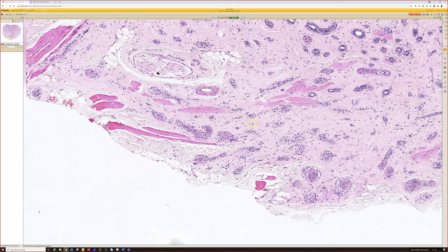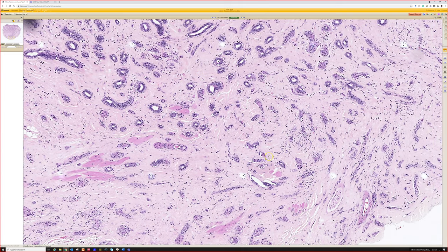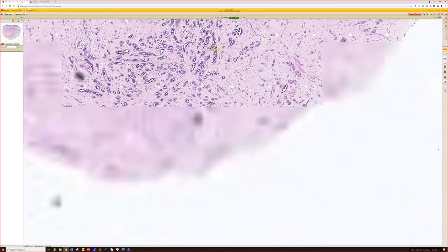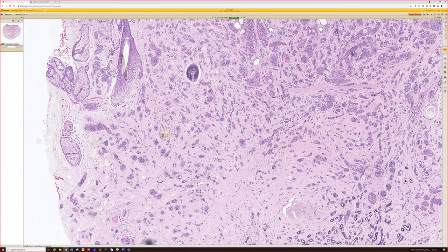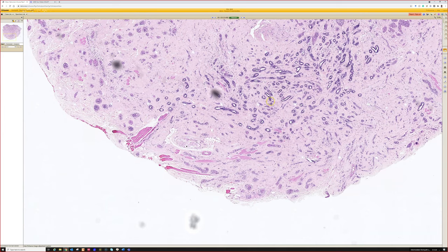So a lot of times to make this diagnosis with certainty, I really need to see a deep, full thickness biopsy. I feel like it's a very hard, if not impossible, diagnosis to make on a shave because they can very closely resemble desmoplastic trichoepithelioma. This one doesn't because it has obvious ducts, but a lot of times they can have areas that look, to my eye, identical to desmoplastic trichoep. So usually I want to see a deeper biopsy, and seeing them invade down in the subcutis and the skeletal muscle is the most helpful thing.